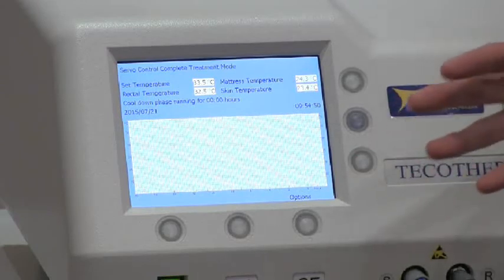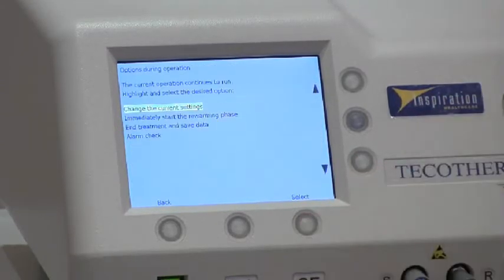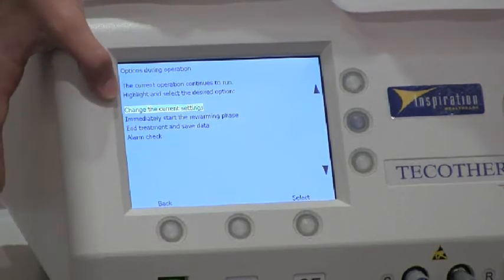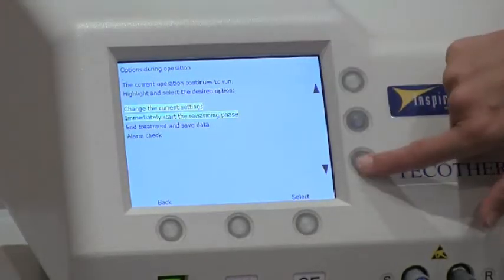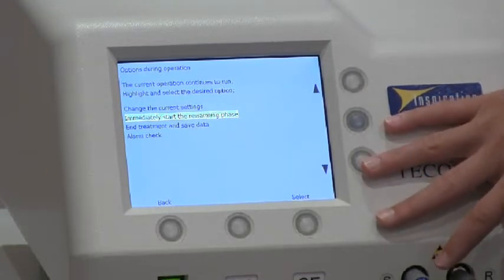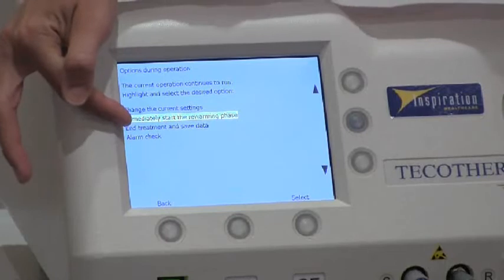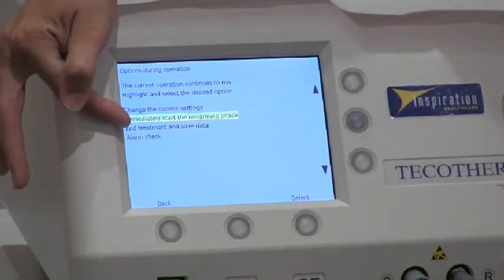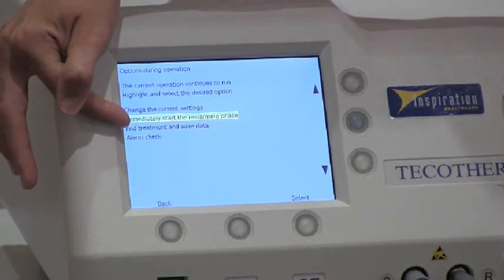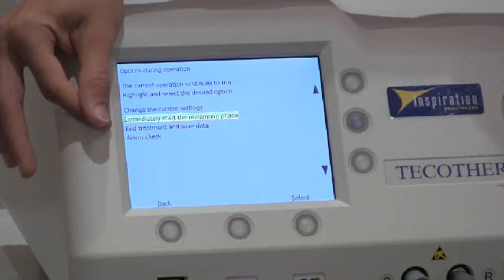Throughout treatment, we have a number of options. If you want to change your treatment parameters, you can go in and change your settings. You can immediately start re-warming or you can end the treatment. There's also an alarm checkpoint, similar to when you logged into the system. If you're worried the alarms aren't working, it will ask you to confirm they are working. If you click No, it will shut the system down.